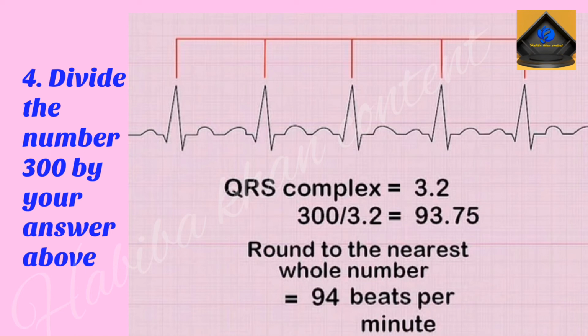There are also disease states that can provoke unhealthy slow heart rates called pathological bradycardias, and diseases that can lead to an unnaturally accelerated heart rate called pathological tachycardias. Speak to the physician if the person you are calculating heart rate for appears to have an abnormal value.